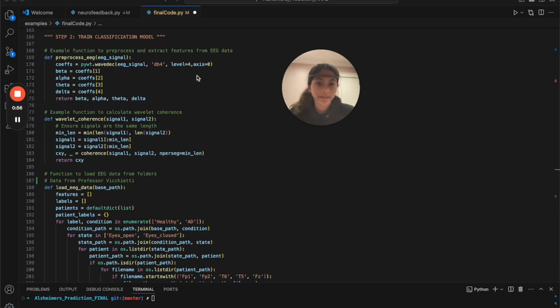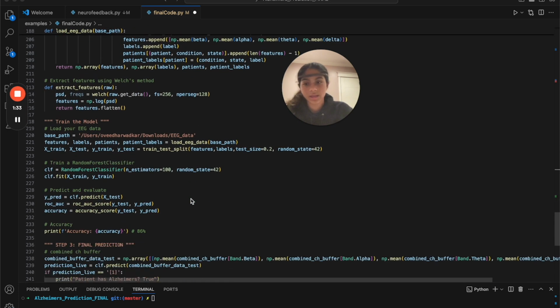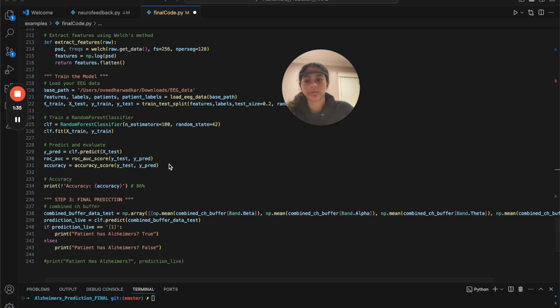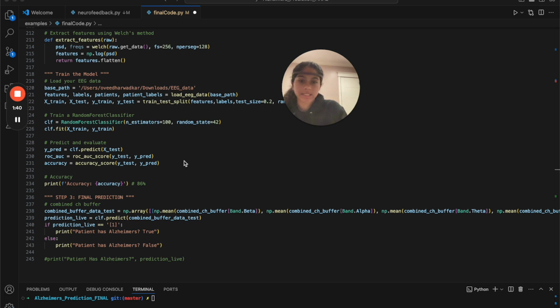Step 2 is training our classification model. What this first part is doing is extracting features from our EEG data. And so once it has these 4 categories, it'll try and see if it can recognize any of the patterns I mentioned earlier in its categories data. If it does, it'll classify the user as having Alzheimer's. Next, we're going to just load the EEG data from our folders. And from here, we're going to be using the random forest classifier, and I got an accuracy of around 86%.